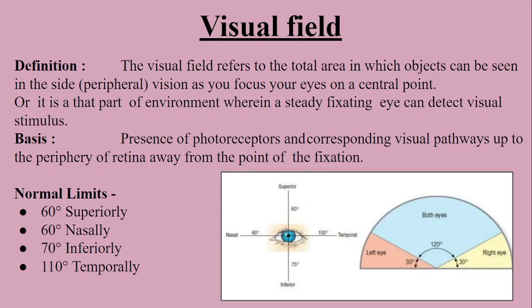In conclusion, visual field testing is a crucial diagnostic tool that helps assess a patient's visual function, detect defects or abnormalities, and aids in the diagnosis and management of eye and neurological conditions.